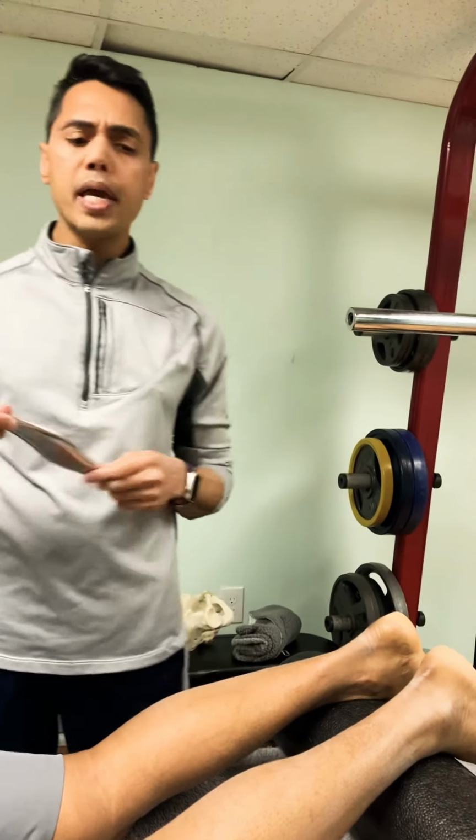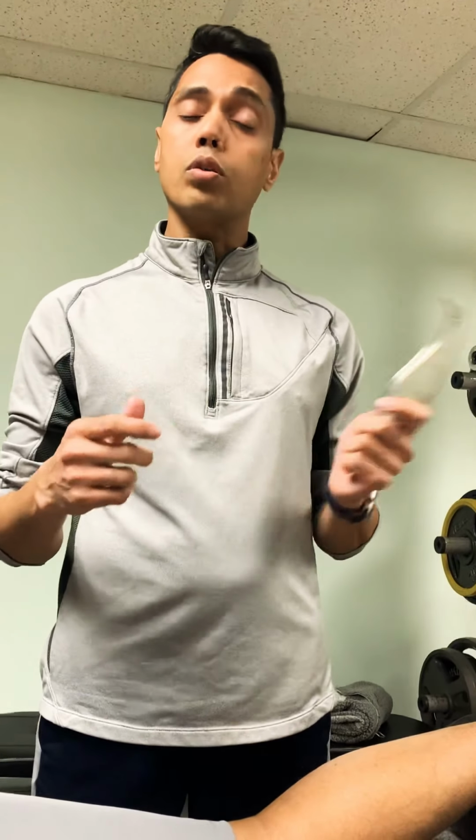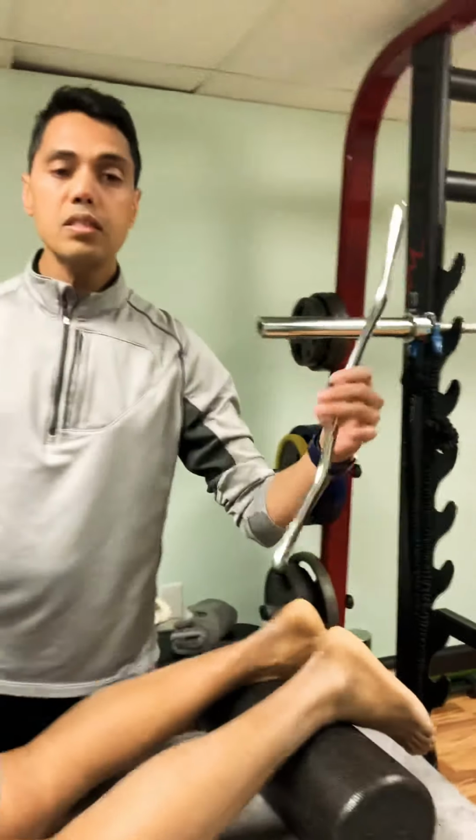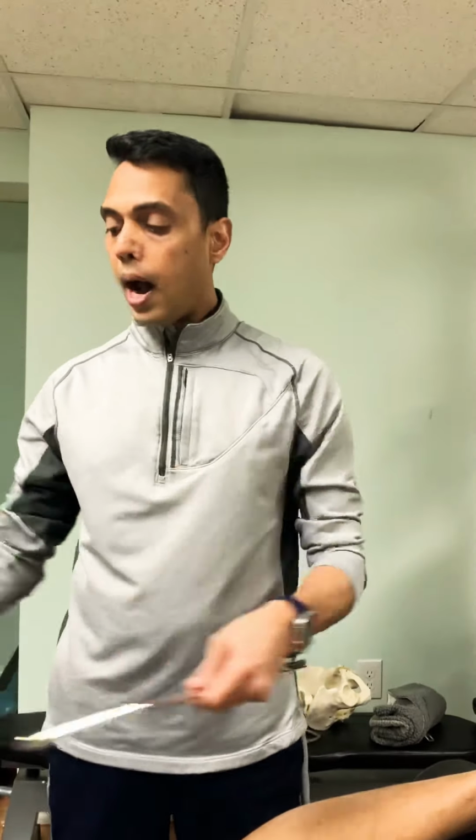For any typical patient, I'll tell you what it's going to be for. The indications are to mobilize any soft tissue structures, including fascia, tendon, ligaments, of course not the blood vessels. You can also mobilize the bone, but it can have a stimulating effect. But definitely on the nervous system and all the superficial and deep fascia, it's a great tool to use. At the same time, you have to know that having different shapes and different sizes is basically for the body types and the area you want to cover quickly.